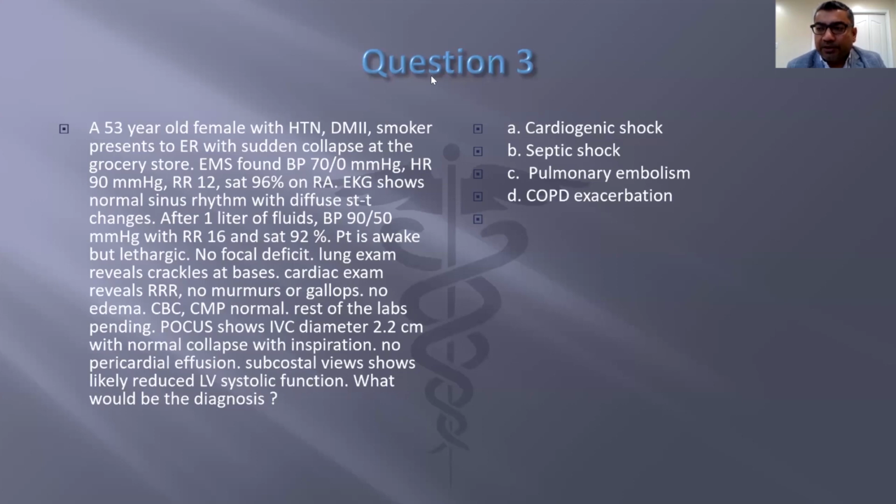And in mid cavity, you usually end up seeing all 6 walls, and it's very hard to miscalculate the LV function. You won't be getting the full EF, but at least you will know it's very low or normal.